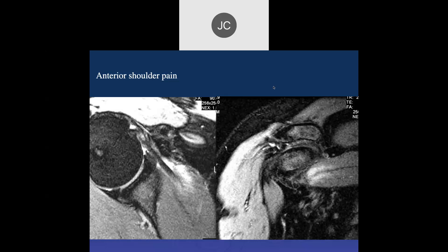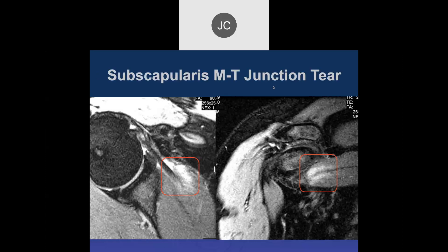On PD fat sat images looking at the subscapularis distally, there's some edema medially in the muscle — so that's a tear. Just remember, especially in young athletes with big muscles, tears of the muscle itself can cause shoulder symptoms.